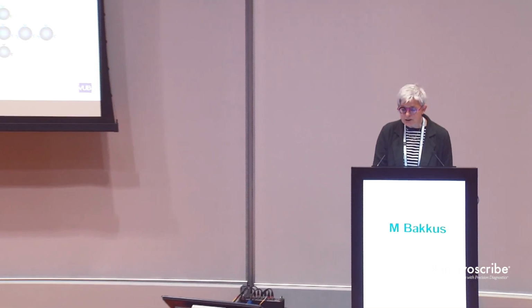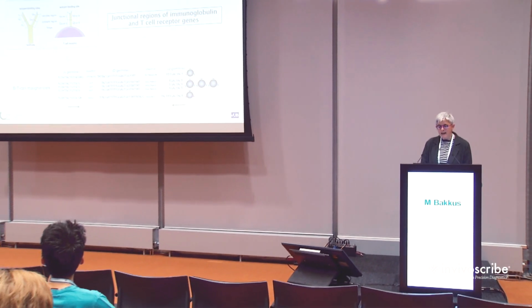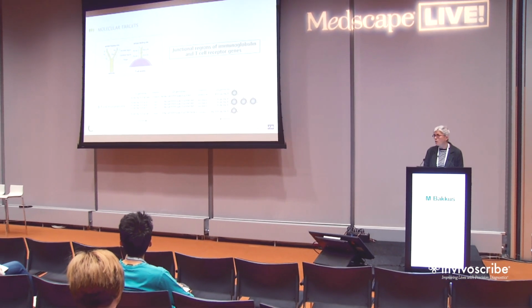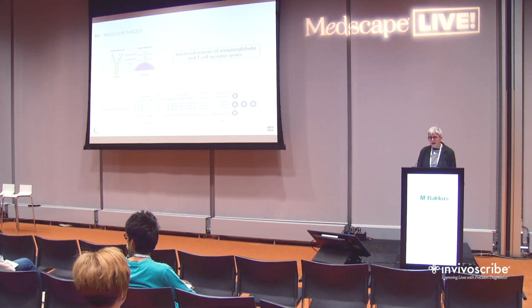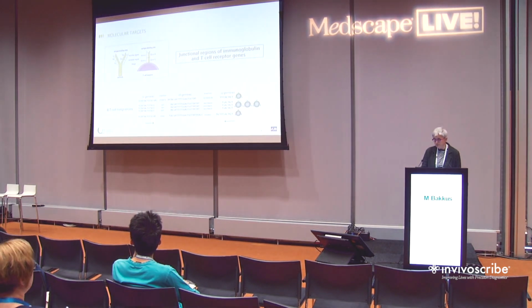First, the targets for these assays. These are the immunoglobulin and T-cell receptor targets, because they have junctional regions that are very variable. They are unique for every B and T cell because of the joining of V, D, and J germline segments, and then you get the N insertions: bases are inserted and deleted in the joining regions. So the joining part is very unique, and therefore it is a very useful clonal marker for all B and T cell malignancies. You can amplify this region using the BIOMED primers or the LymphoTrack primers.